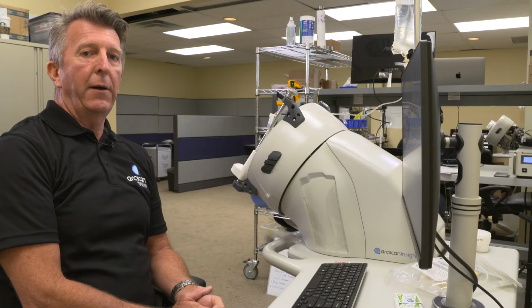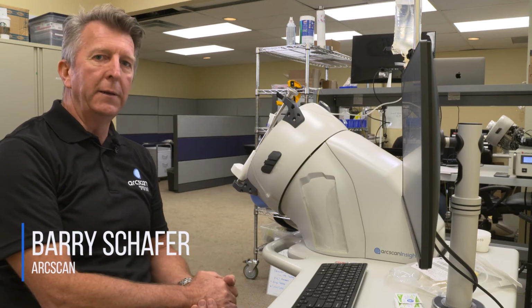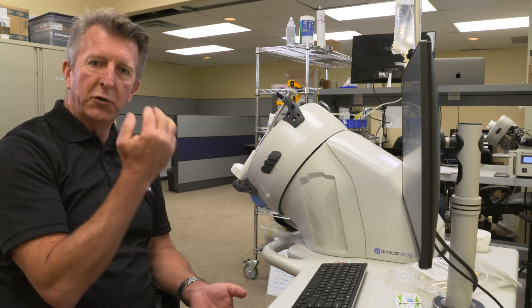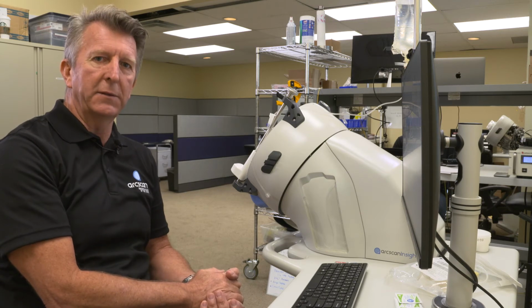I'd like to go over our anterior segment scan, maybe used for glaucoma screening. This scan is a single bi-canthal plane scan, less than half a second to grab the image. Do both eyes. Total seat time should be less than 4 minutes to get both eyes scanned.